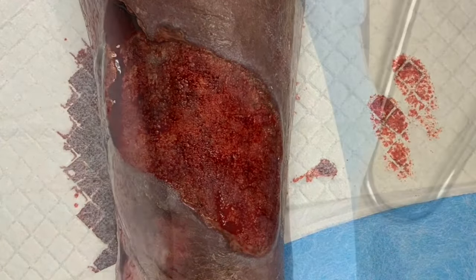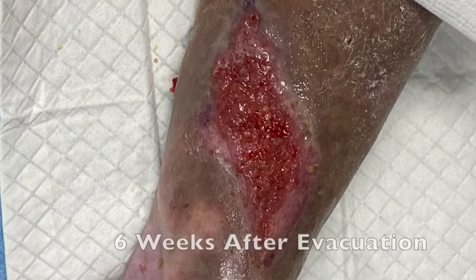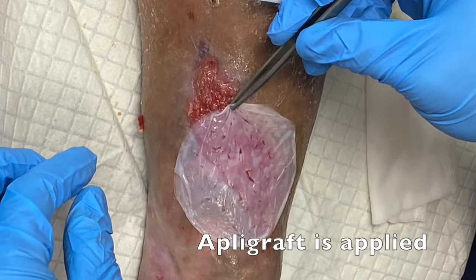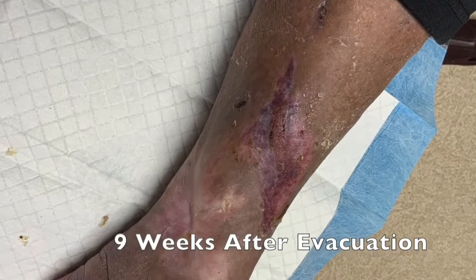Here you can see it a week later — we initiated a wound vac to help granulate tissue into the wound. As several weeks went by, we applied an apligraph, which is a bioengineered skin substitute, and we eventually went on to heal this wound.